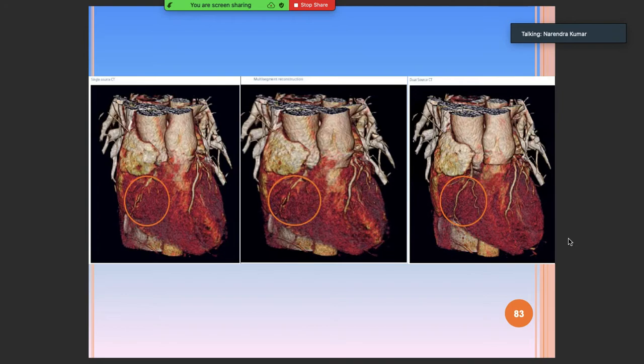We should understand there is still a radiation risk even with this imaging, although the risks are higher with the MDCT compared to the EBCT, in fact. Especially with calcium scoring, we can expect 1 to 3 millisieverts. However, for retrospective gated CT angiography, we can expect 8 to 22 millisieverts, in fact.